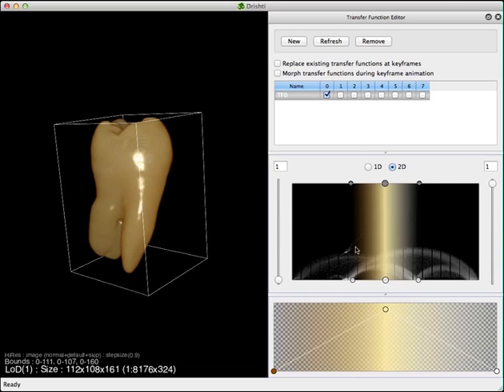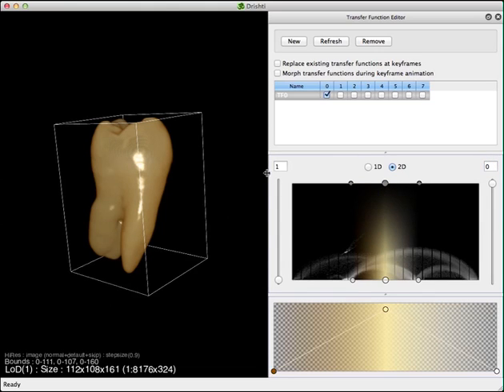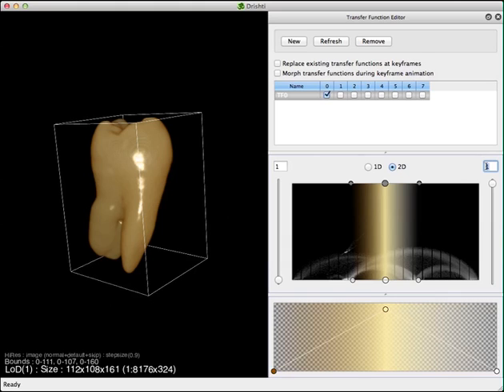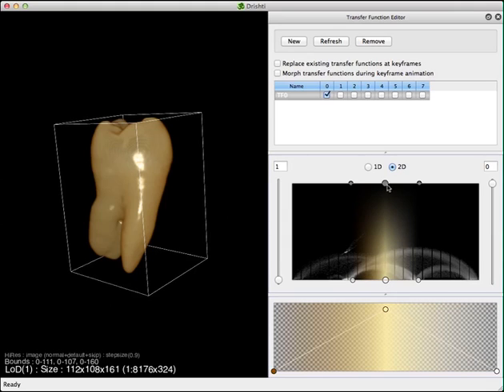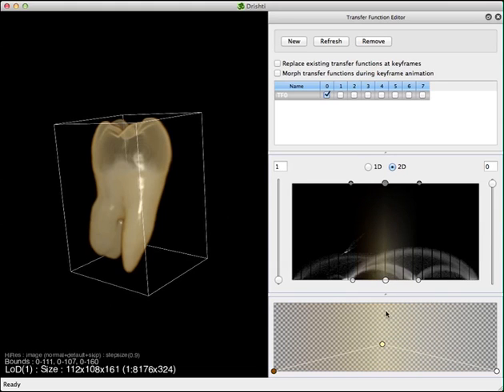These two numbers control the opacity of the two end points of the spine. This one controls the top part and this one controls the bottom part. If I set it to one you can see it at full opacity, and if I set it to zero it is at low opacity. The opacity changes linearly from the first spine point to the last spine point.